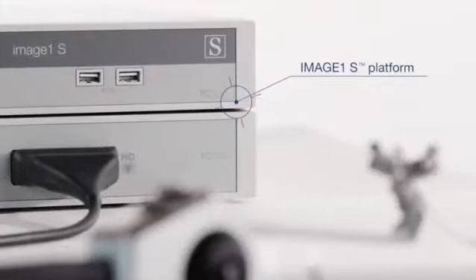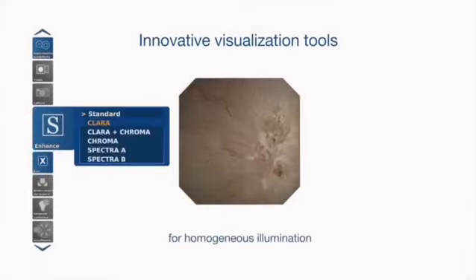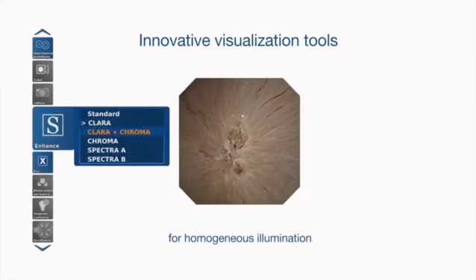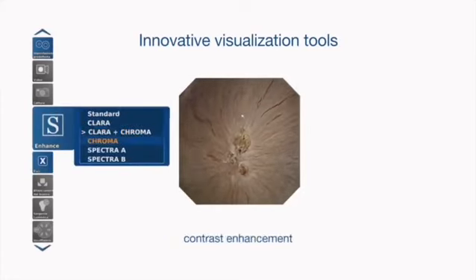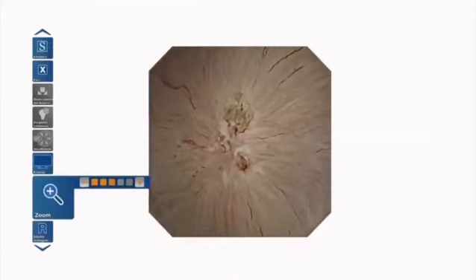RGB sequential endoscopes offer potential superior color accuracy but suffer from motion artifacts. Color chip endoscopes are more popular due to good color and natural reproduction of motion. Recent advancements in imaging include high-definition imaging, narrow-band imaging, and wide-angle close-focusing optics. An understanding of the basic components of the endoscope will help the endoscopist troubleshoot many equipment problems.